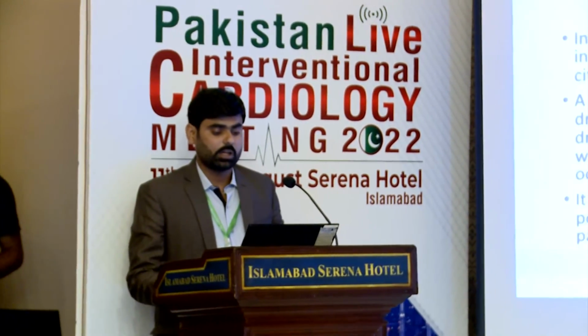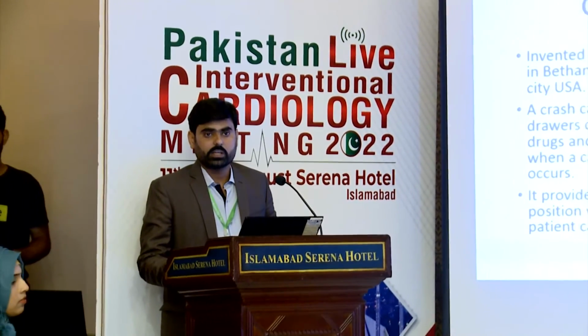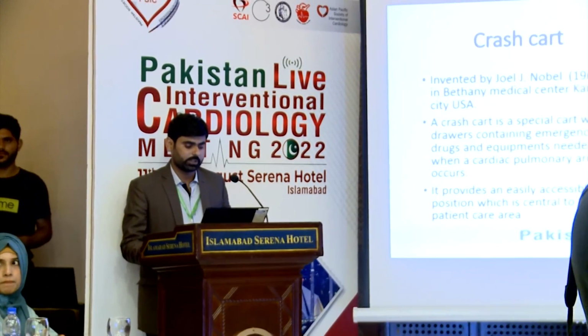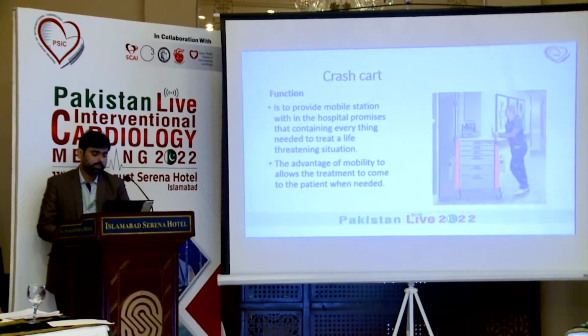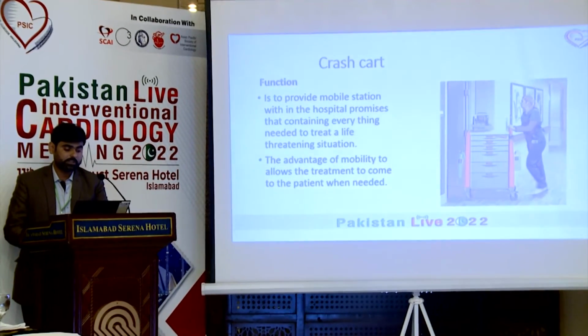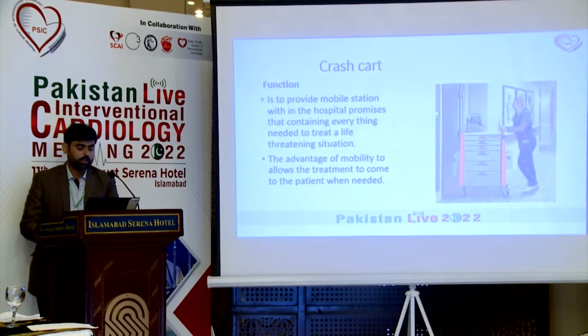A crash cart is a special cart with drawers containing emergency drugs and all life-saving equipment in case of any crash condition or patient going into cardiopulmonary arrest. Functions of the crash cart: it provides a mobile station within the hospital premises containing everything needed to treat life-threatening situations. The advantage of mobility is that it allows treatment to come to the patient when needed.